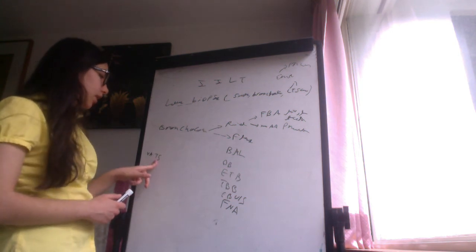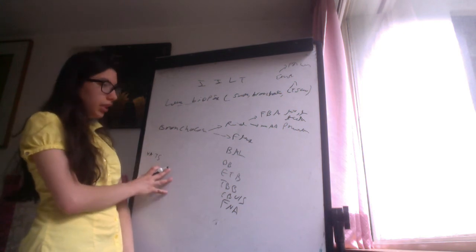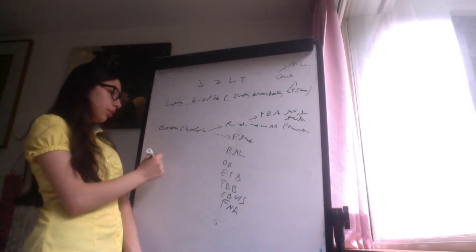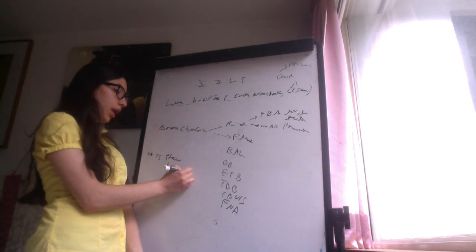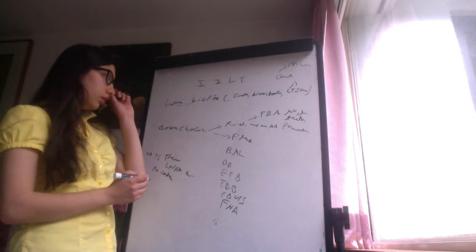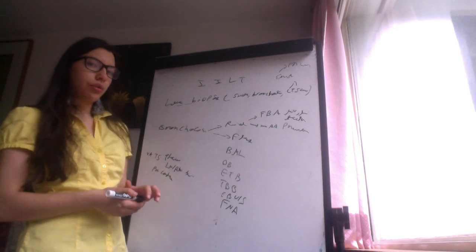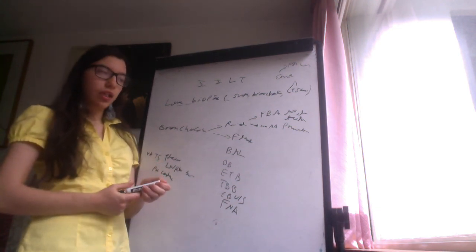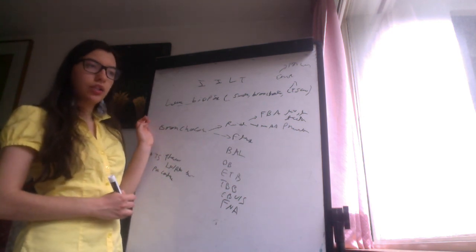And the video-assisted transthoracic surgery. This is a minimally invasive technique, and the indications are similar to lung biopsy, but also pleurodesis, lung or pleura biopsy, and pulmonary contusion. The open biopsy has more risk than the other procedures and will be performed only after minimally invasive procedures have failed to yield a diagnosis, and the patient should get general anesthesia and should stay at the hospital.